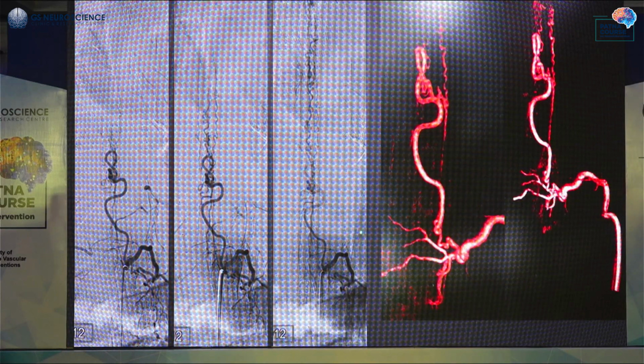There are situations where, if you have a good machine, you can take a good 3D image as well, which will give you a good understanding, 3D anatomy of how your catheter is going to move and how far you need to go. You can define your limits. You can actually define the fistula vein, the fistula, then the arterial segment. So if you go as close here, then you're good. So the 3D images are possible.